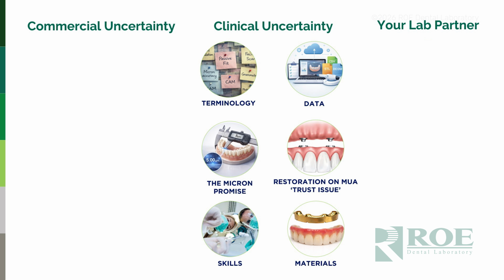And then we've got questions around materials. Should we have monolithic zirconia? Should we put a tie bar in it? Should we use castable, milled? Should it be acrylic? Should it be PMMA? The list goes on. So we need to make sure that we have trust or a fundamental belief in the materials that we're using.